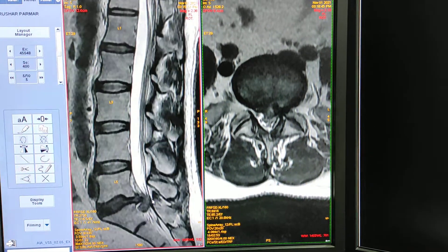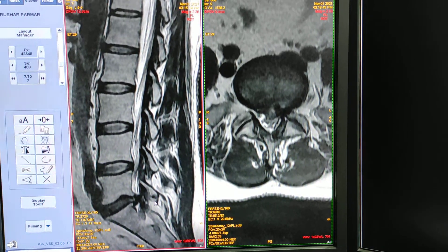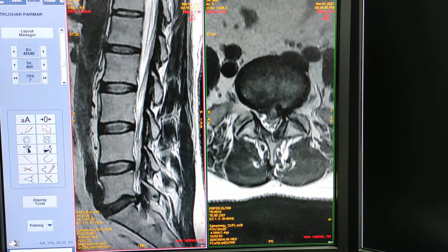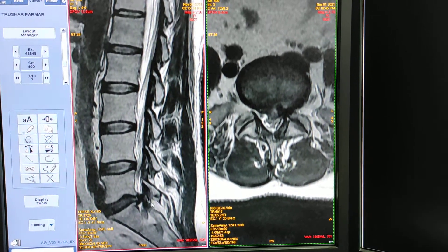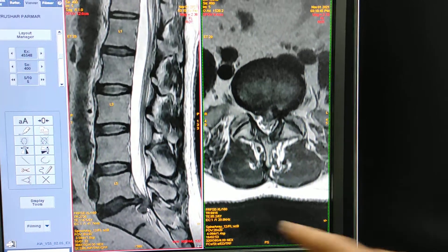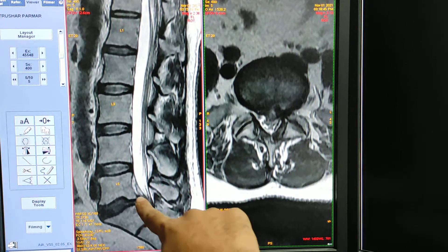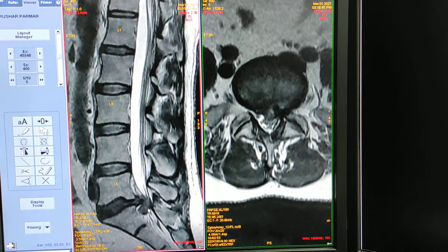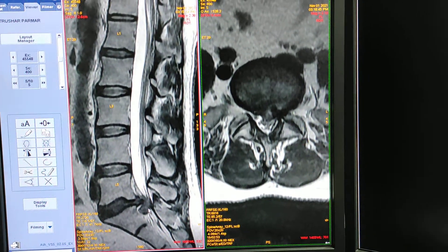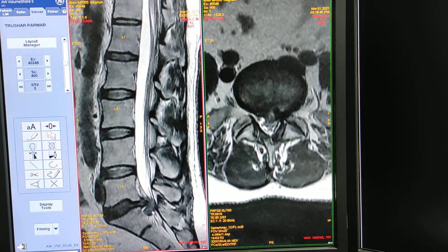We can call it a large extruded disc migrating inferiorly. Upward direction we call superior, and downward we call inferior, so this is an inferior disc herniation.